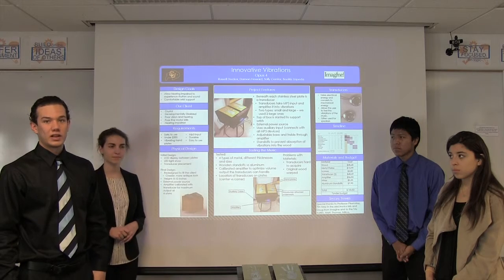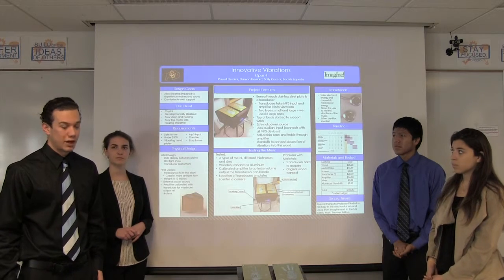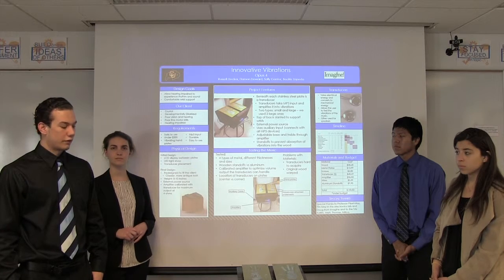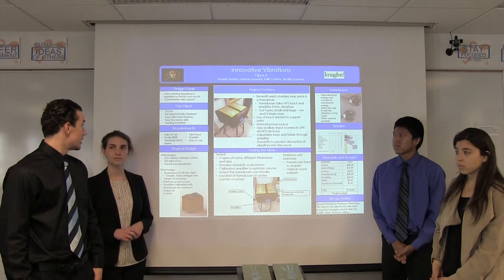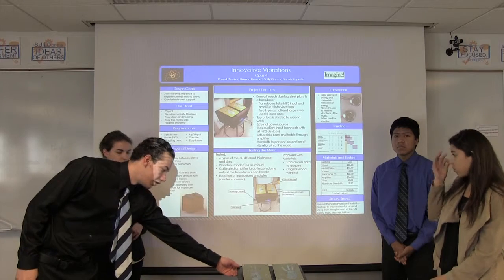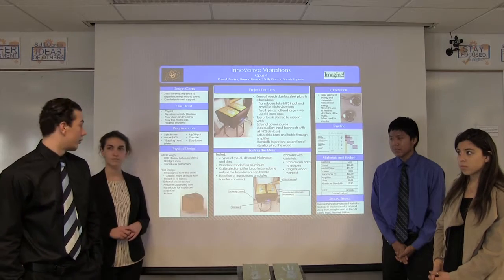This was specifically designed for our client named Crystal, who is developmentally disabled and is hard of hearing. So this was just a good design, a good product for her to experience sound. The requirements: it had to be safe to use, so we sanded the edges and made sure that there are no sharp points or edges to hurt someone.